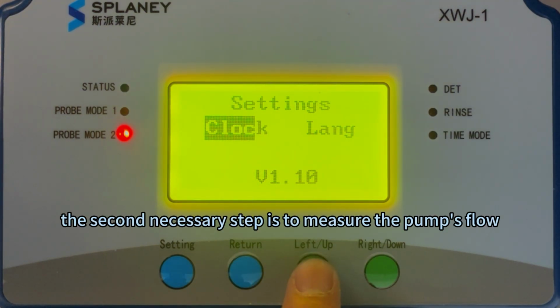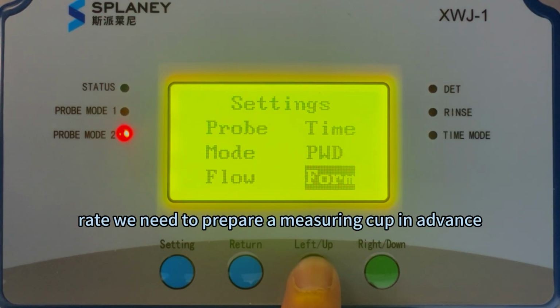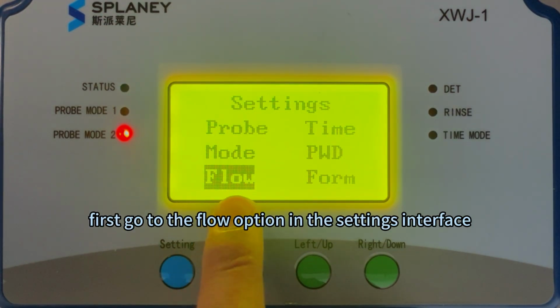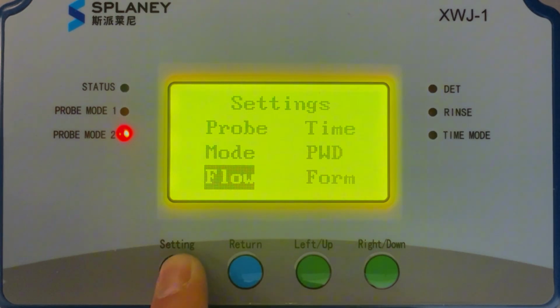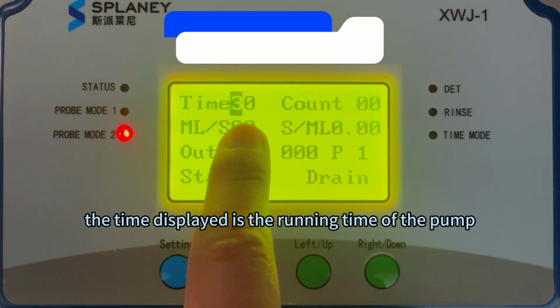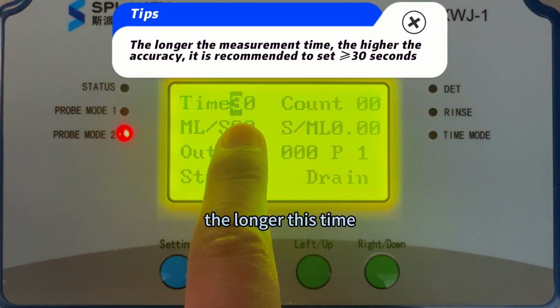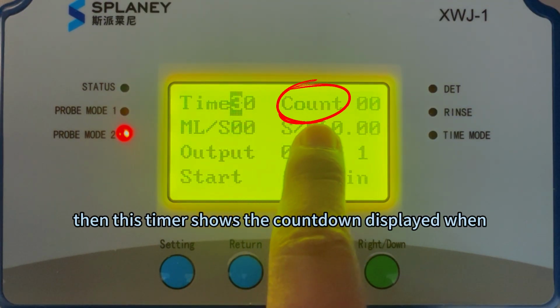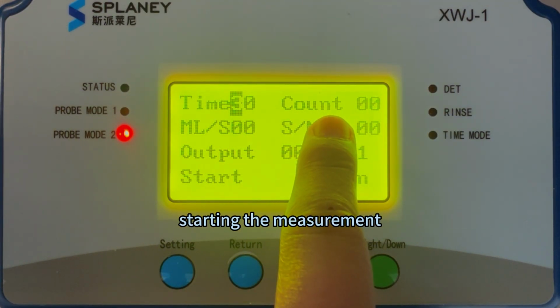The second necessary step is to measure the pump's flow rate. We need to prepare a measuring cup in advance. First, go to the flow option in the settings interface. Click Set to enter the interface. The time displayed is the running time of the pump during the flow measurement. The longer this time, the higher the accuracy of the measurement. Then this timer shows the countdown displayed when starting the measurement.